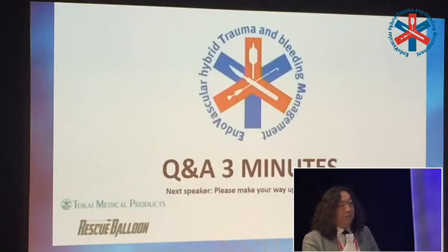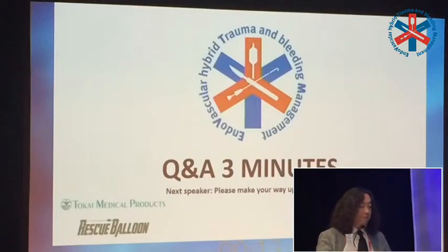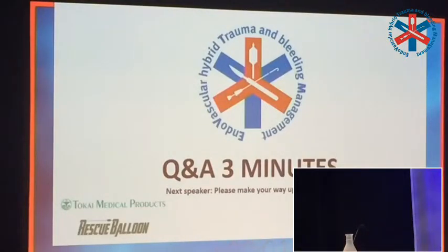In Tilburg, we have 2 trauma rooms with 1 CT scanner on rails in the emergency room department, and 24/7 trauma surgeons in the hospital, and the two together are time-saving and life-saving, I think. A CT on rails really goes fast. Great, that brings us right up to time. Thank you very much.